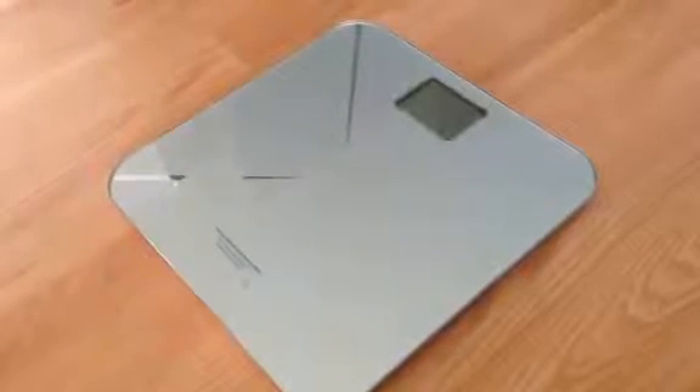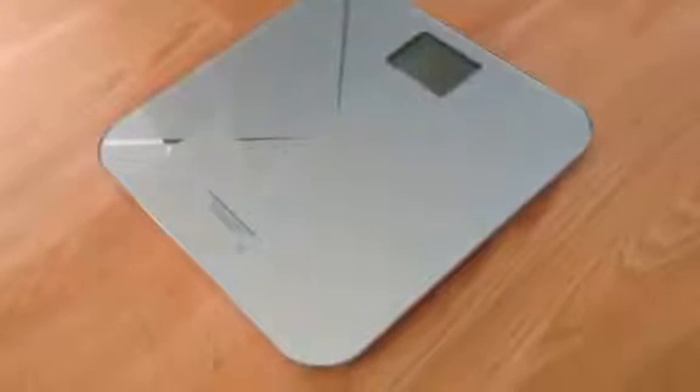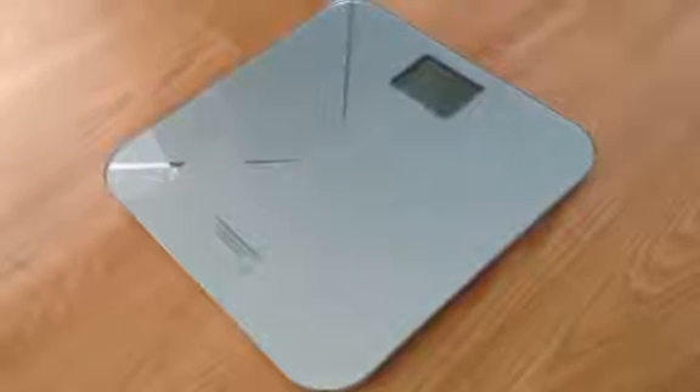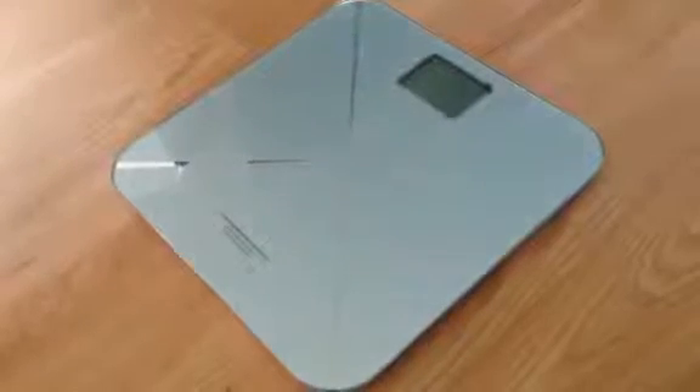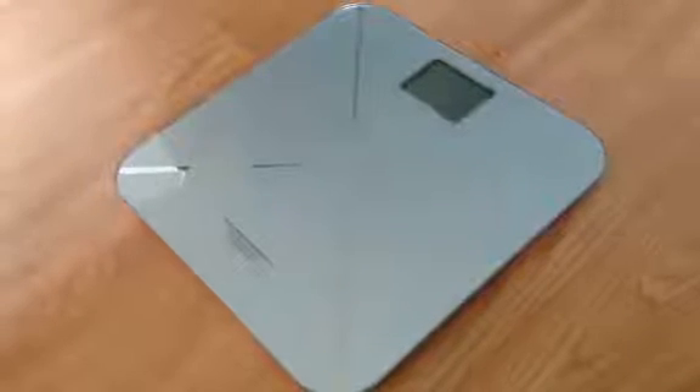We're doing a review here on the Smart Weigh Smart Tare Scale. This is a scale that's perfect for mom and baby or your pets, but it can also be used as a normal scale. It has pounds, kilo, and stone measurements, as well as the tare feature, which is really nice.